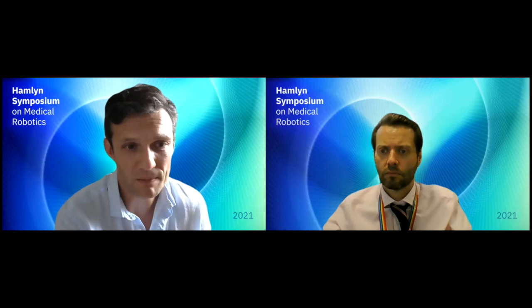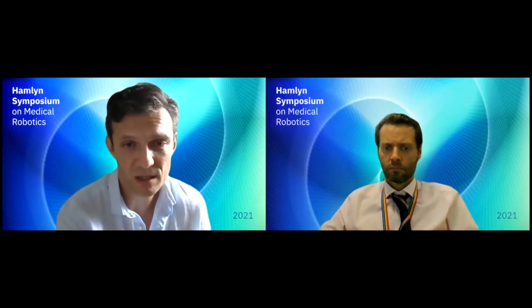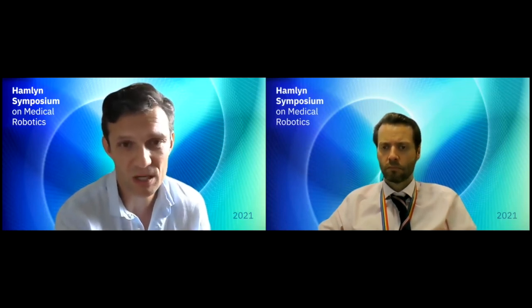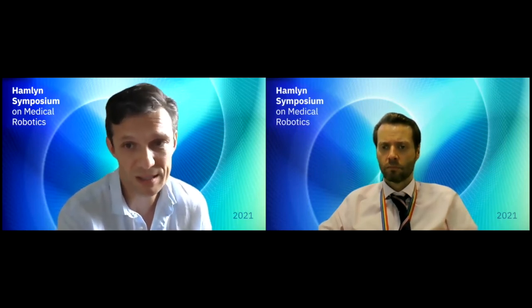And we've also been evaluating using the data set that I presented, the SURF-CT data set, which is generated from tomographic data. So those are the two data sets that we use for evaluation. They're not without problems, but it is the best that is available today. I'm really excited, I'm hoping that over the next year, we'll be generating more and more data in this space, and hopefully getting it to be more and more refined. So that's how we've been doing the evaluation so far.